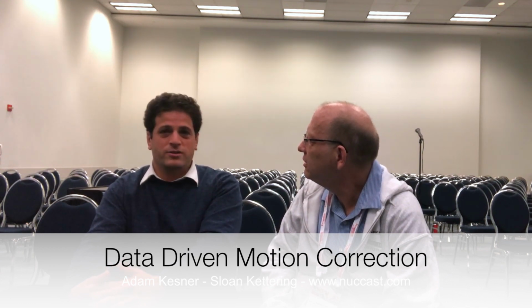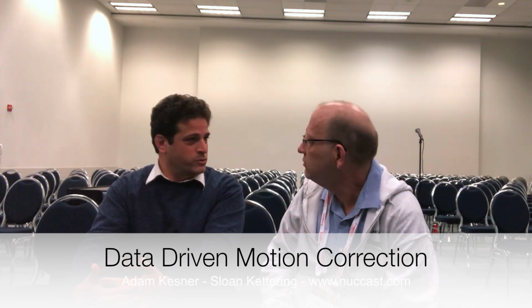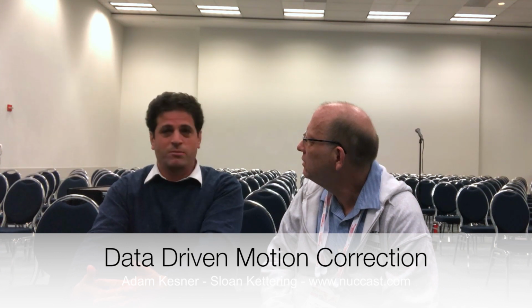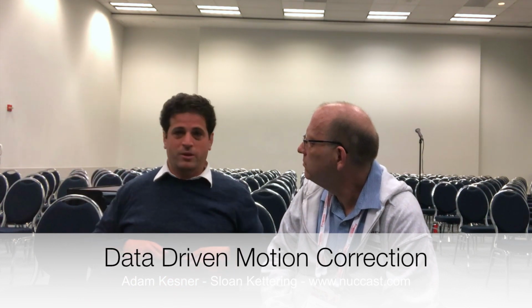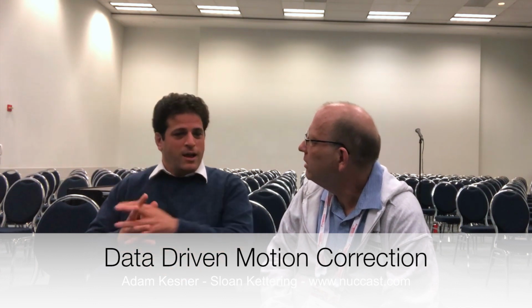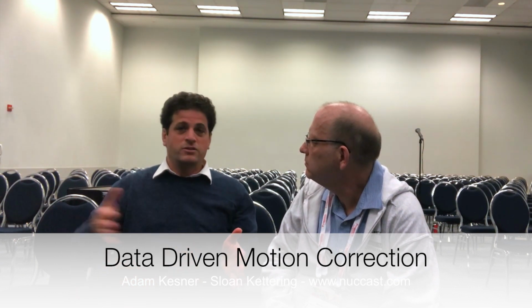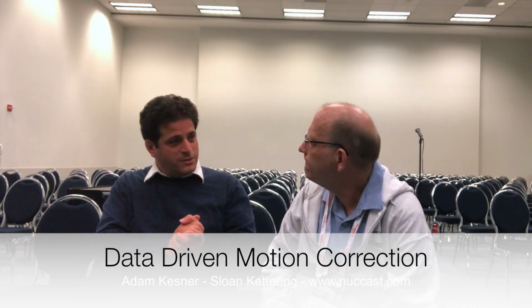Now, data-driven motion correction is an alternative to what I would call the standard right now, hardware-driven motion correction. So in the 2000s, we recognized patient motion was a problem, and most vendors brought solutions up to the market pretty much based on hardware, so using a camera or pressure belt. You could set the patient up with some hardware-based motion tracking equipment. And once you characterize the motion, the different vendors also brought us solutions on how to use that motion characterization to generate motion-corrected images. So we've had these solutions for a while.